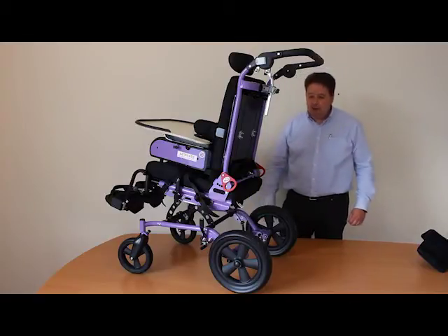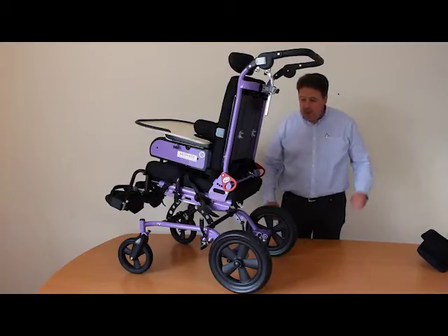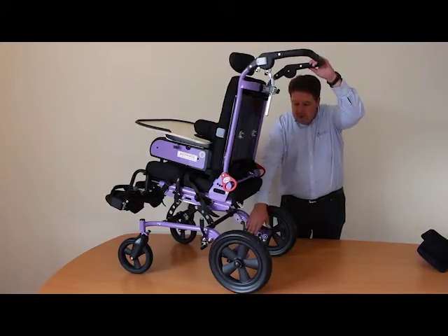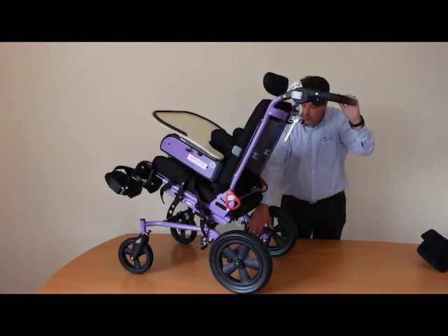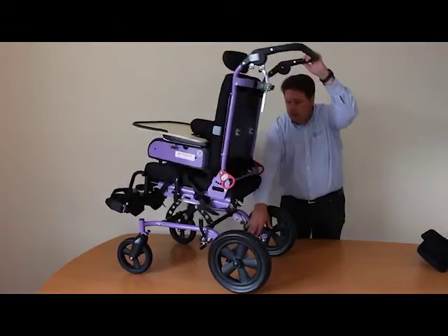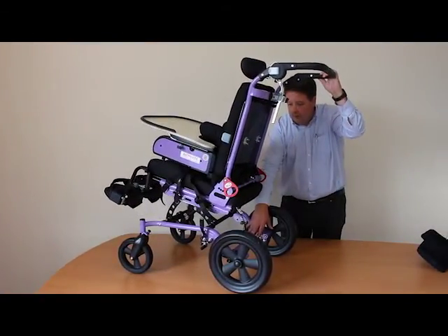So here it is, the Corgi Sprint. Let's show you the tilt. The tilt mechanism is here on the back bar down on the base. Press with your foot and then move to tilt.